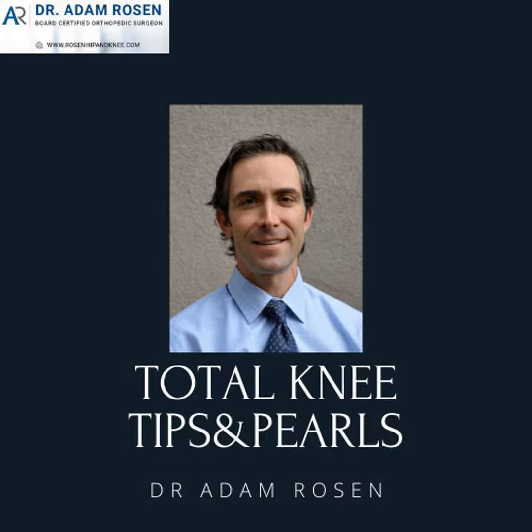But before you identify the plane and then make the arthrotomy, the thing that I do at this point is make sure that I expose. I do not create a large amount of dead space, but I make sure I expose about a centimeter on both sides of where the arthrotomy is going to be, because at the end of this big case, you're probably going to be tired and you're going to be closing the wound. And you want to make sure that you can truly identify the medial side and the lateral side so you have a good arthrotomy closure.